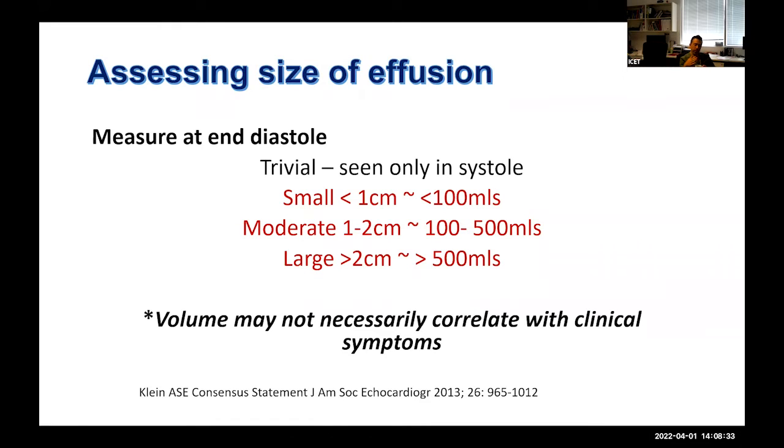If you're measuring it around the site of the atria rather than where the ventricle is, if you're trying to gauge the depth of a pericardial effusion between the atria and the pericardium, at end diastole your atria is probably not going to be at its fullest. Because if you're looking for atrial chamber collapse from the pericardial effusion, the timing and measurement could be different, couldn't it? I think so. Basically, what you would do is take the largest measurement in whatever view you saw, and it doesn't really matter so much where you take the measurement from. But I take your point.